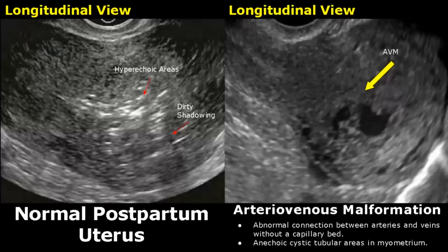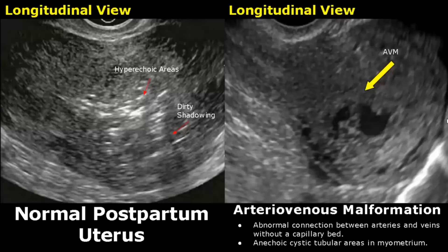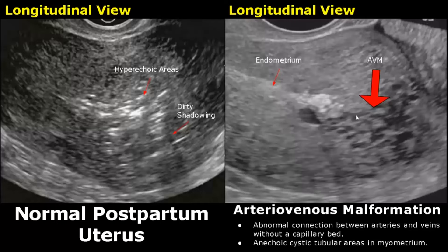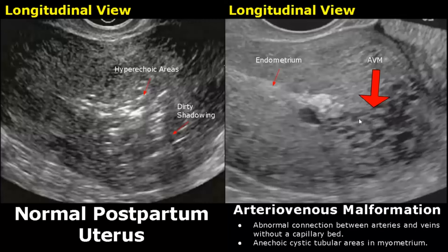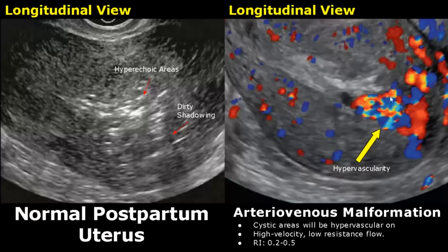Arteriovenous malformation is rare but can occur after a miscarriage, dilation and curettage, or any uterine injury. It presents with heavy vaginal bleeding and is an abnormal connection between the arteries and veins without a capillary bed. On ultrasound, anechoic cystic tubular areas are seen in the myometrium. On color Doppler, these cystic areas will be hypervascular, showing low-resistance, high-velocity flow with a resistive index between 0.2 to 0.5.